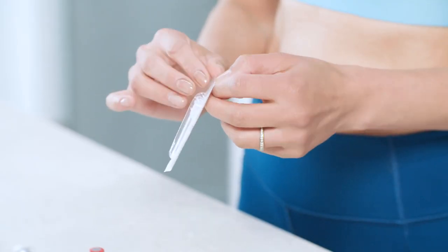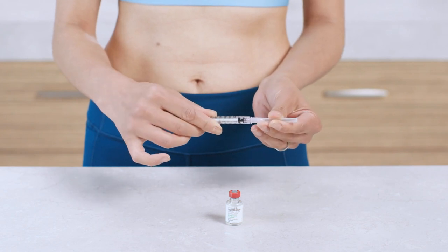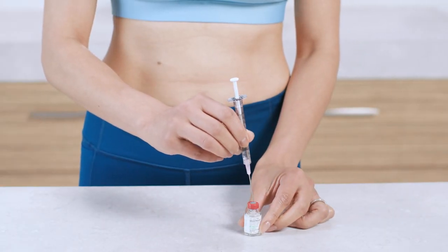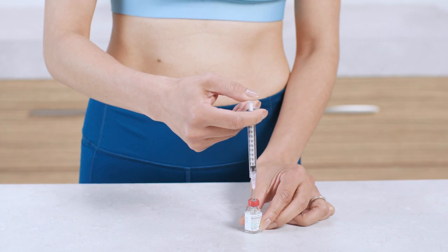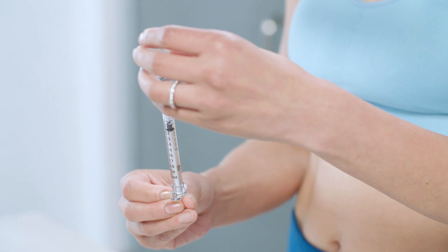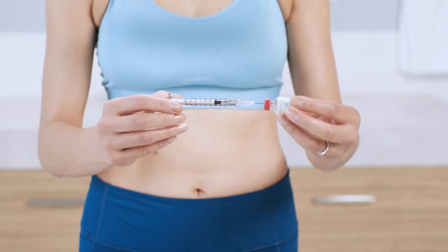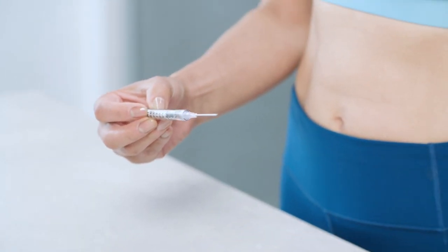Unwrap the syringe and drawing needle and twist the needle onto the syringe, then remove the needle cap. Draw air into the syringe by pulling back the plunger to the ML or CC marking that matches your dose. Place the vial on a flat surface and insert the needle through the rubber stopper and into the vial. Gently press the plunger all the way in, which pushes the air into the vial and makes it easier to withdraw. Without removing the needle, turn the vial upside down. Make sure the tip of the needle stays submerged in the solution as you slowly pull back the plunger to withdraw your dose. You'll only be using a portion of medication for every injection, so it's really important to double check and give yourself the right dose, not the entire vial. Then remove the needle and syringe from the vial and replace the cap.